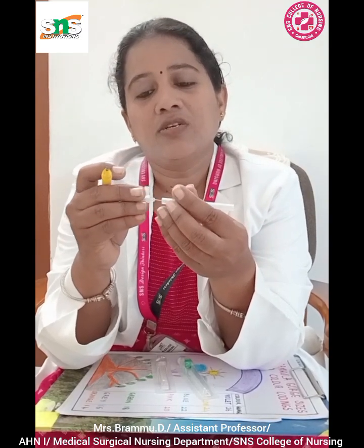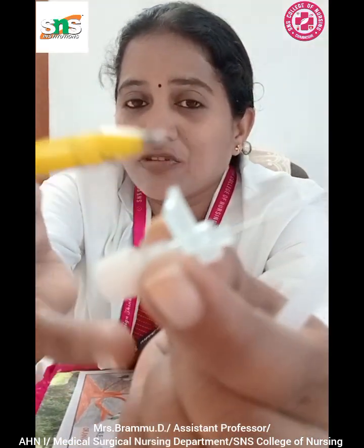Next, we can see about the needle grip, now that the flashback chamber is completed. The needle grip provides ergonomic support during insertion. I would like to come closer. Yes, please see. So this is the needle grip, and it will act as a grip.